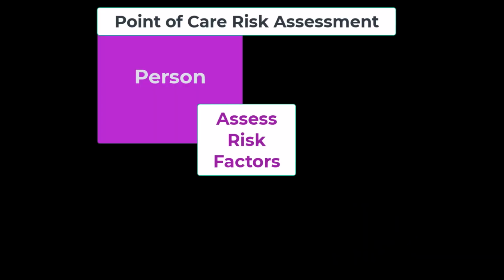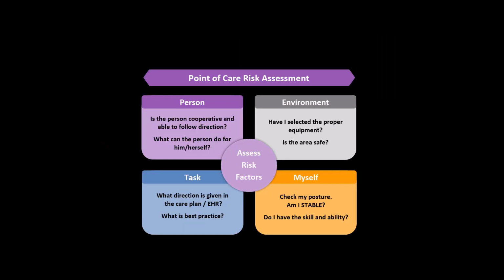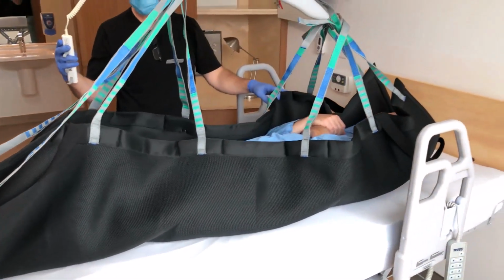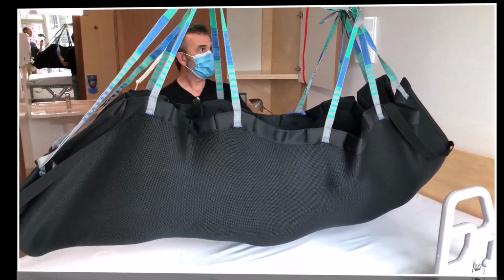Always complete a point of care risk assessment prior to any patient handling care. This assessment may be displayed like this on any paperwork or care plan. In this video, we will explore the many uses of ceiling lifts, their basic functions and components.